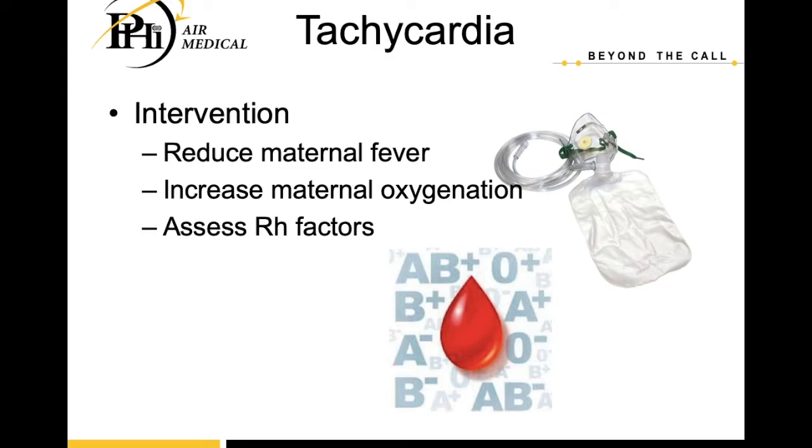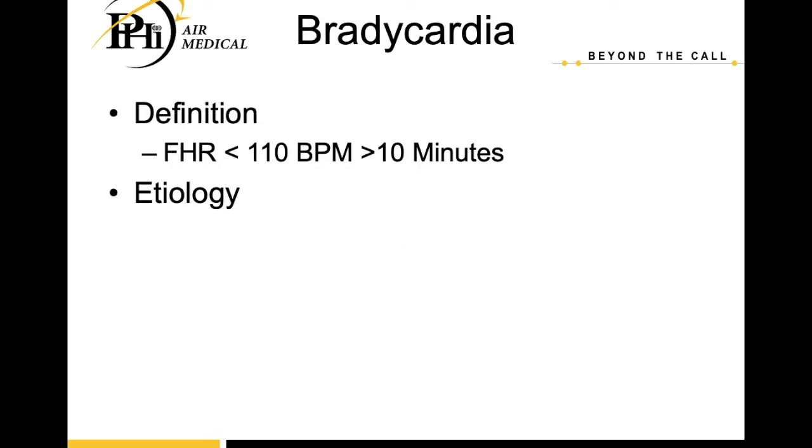On the flip side of that coin, we have fetal bradycardia, which is defined as a fetal heart rate less than 110 beats per minute for more than 10 minutes. The etiology of a fetal bradycardia is also far-reaching, just like with the tachycardia.